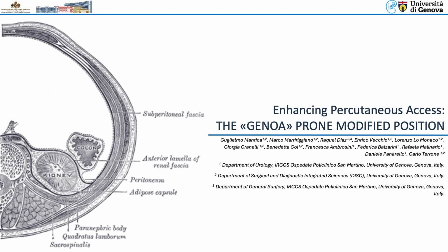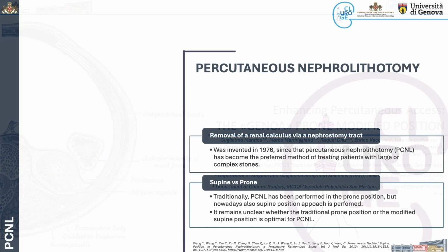Enhancing percutaneous access, the GENOA Prone Modified Position. Percutaneous nephrolithotomy is the preferred technique for managing patients with large or complex renal stones. However, there is still debate regarding the optimal patient positioning, traditional prone versus modified supine.